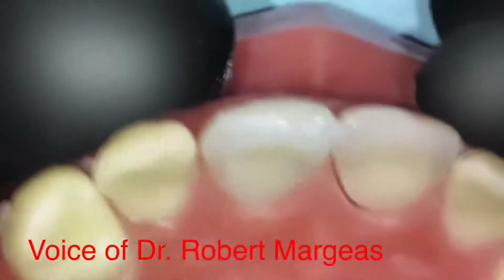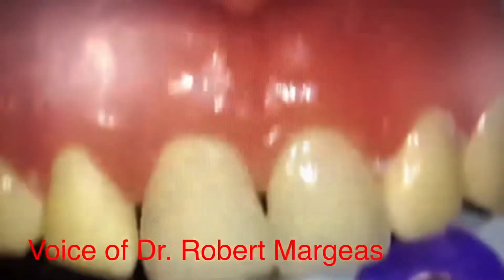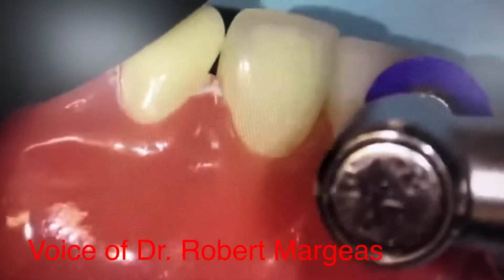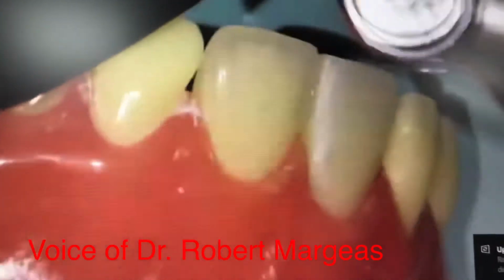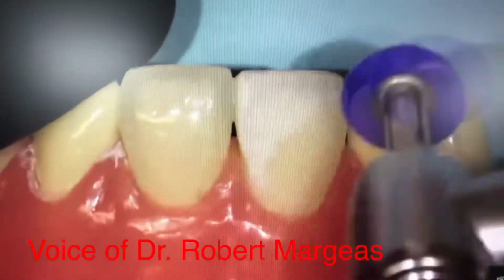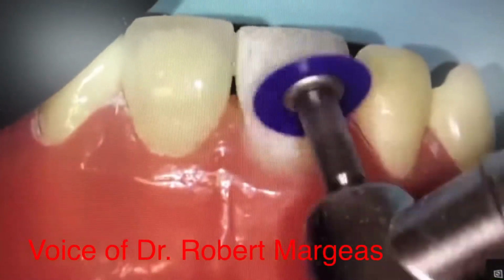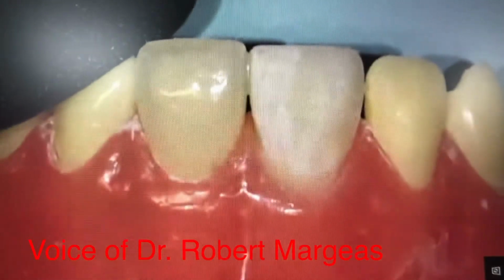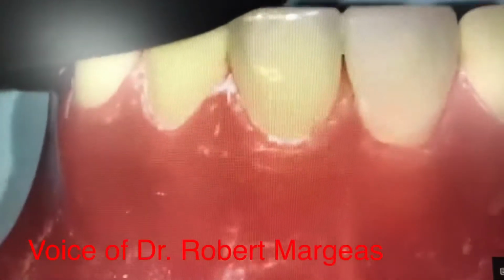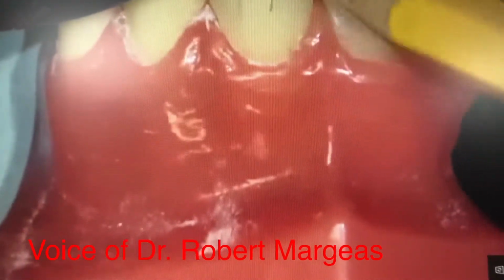Okay. So you can start to see the line angles and the shape of the tooth similar to the adjacent tooth. So once again, I want to make sure we get the line angles right and work between them. And you'll notice that there's not a lot of developmental depressions on this tooth. There's not a lot compared to the adjacent tooth when you look at it. You maybe see a little one like here where it shines right here. There's a depression. And then right here there's another depression.